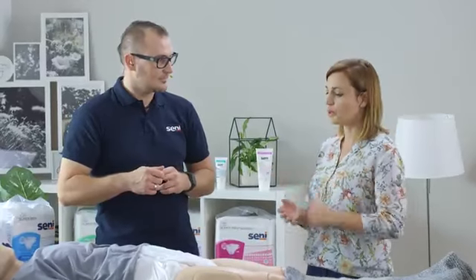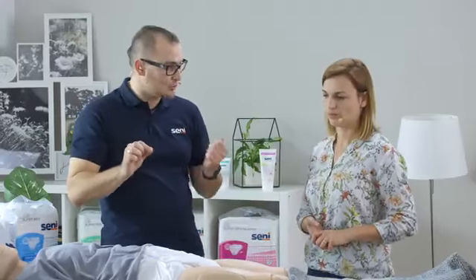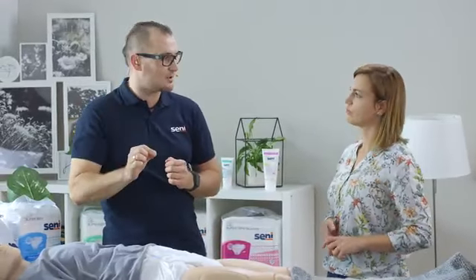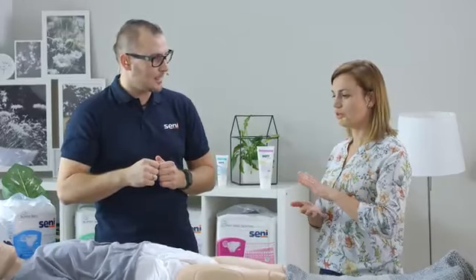Over the course of a day, when we change absorbent products more often, we need less absorbency. And at night, when we want our patient to sleep all night, and we also do not want to get up to change the products, we need higher absorbency. Exactly. We want the patient to sleep peacefully, that is, to have dignity, to sleep peacefully all night without having to change clothes. We have different levels of absorbency.